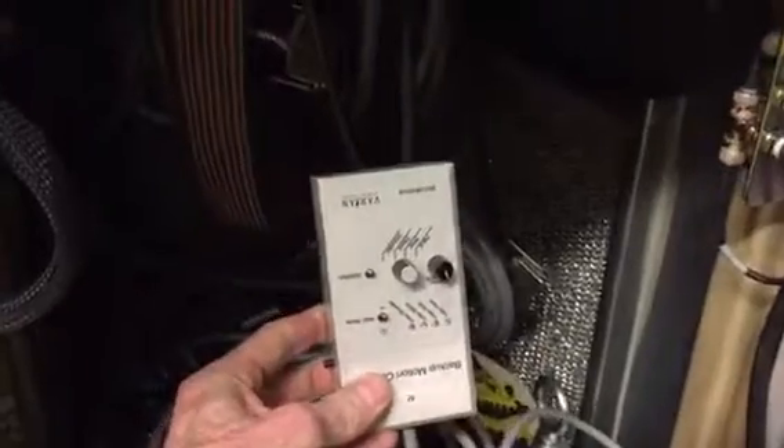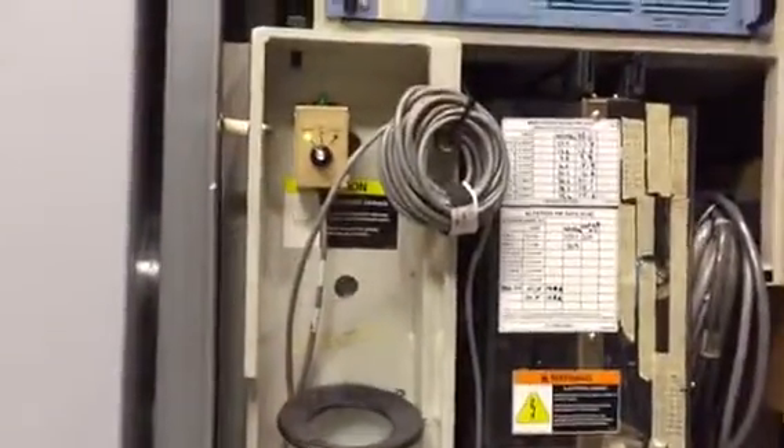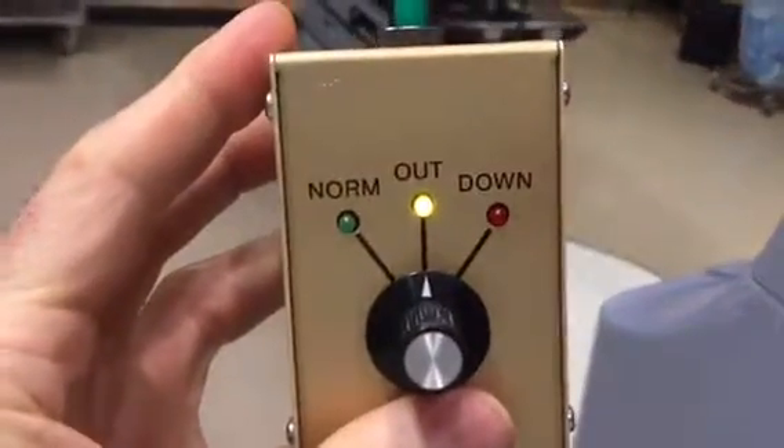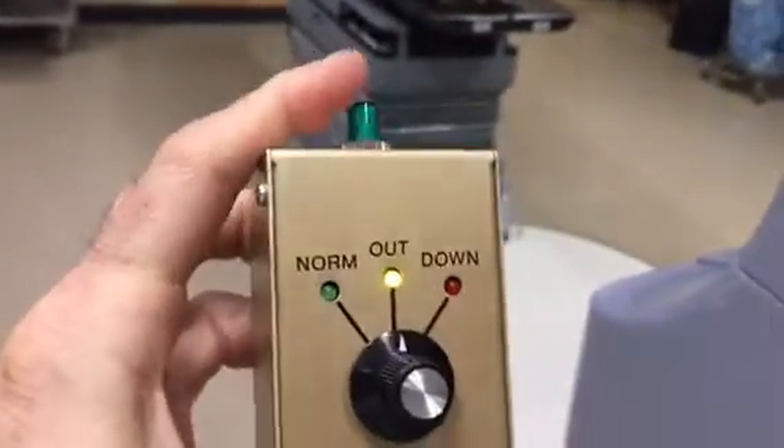Look for the emergency pendant. This is not the emergency pendant — there it is. Remove it. Switch it to out and press the button.